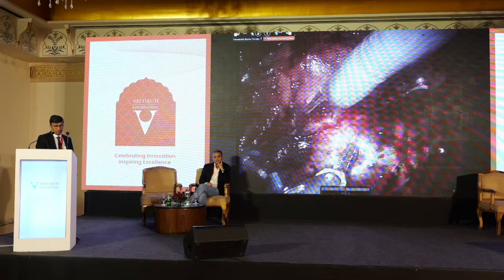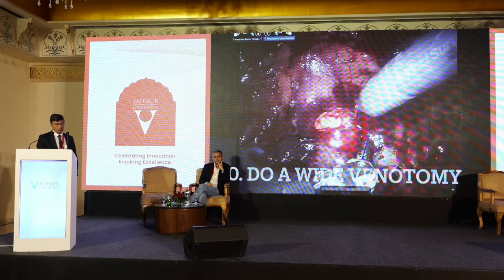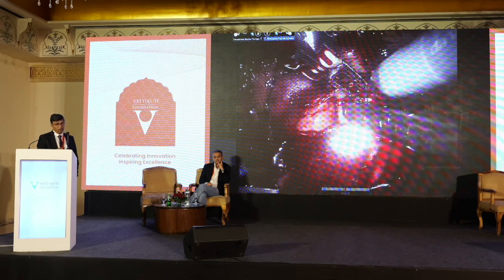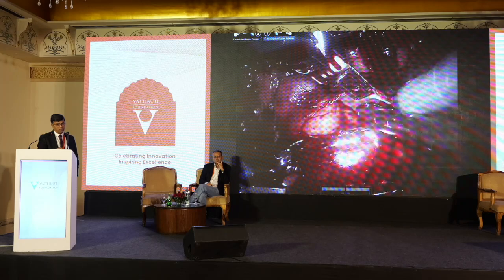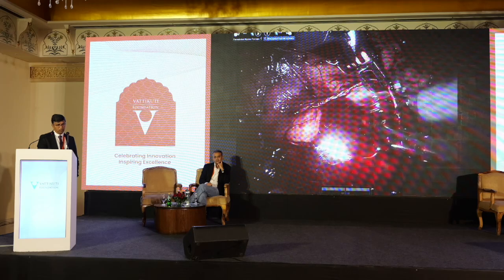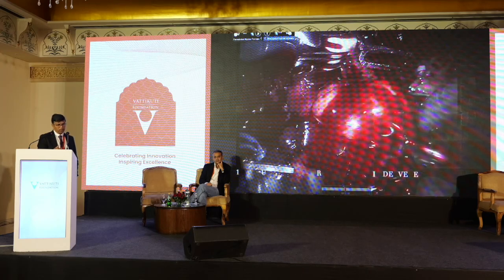So once the clamping is done, open the IVC judiciously. Don't hesitate here and make a small opening. Open it so that the entire thrombus comes out in toto. That's the most important thing, because if you open just a little bit and tend to break the thrombus, it's not an oncologically correct procedure. Again, you can see the bleeding. That's because of the lumbar vessels which tend to come up.